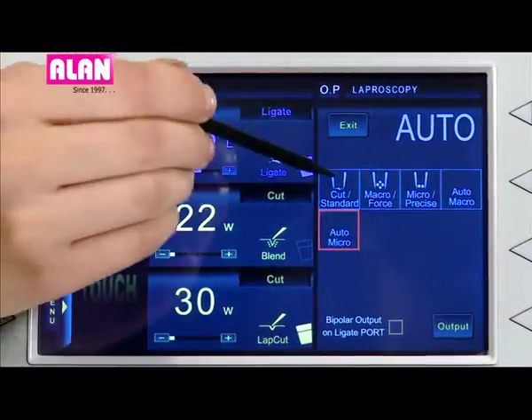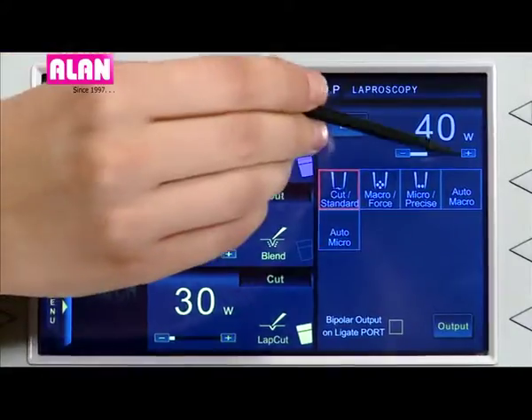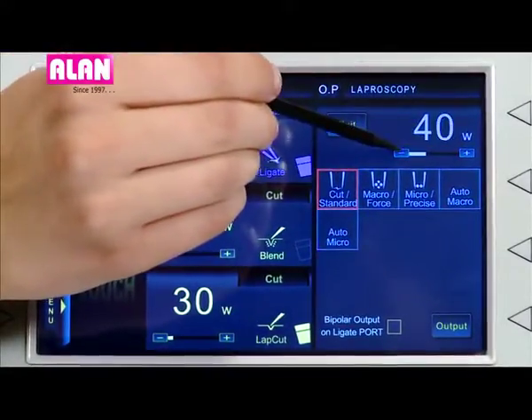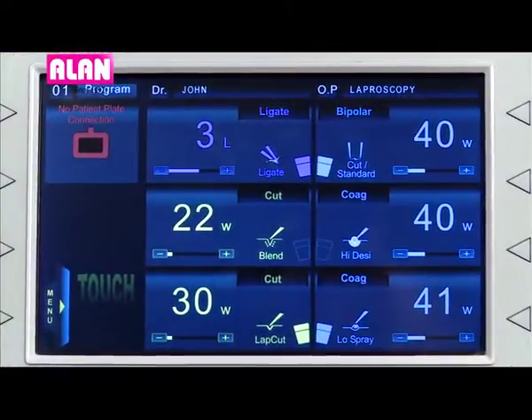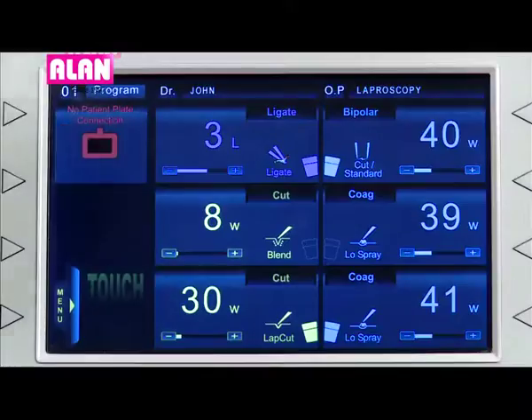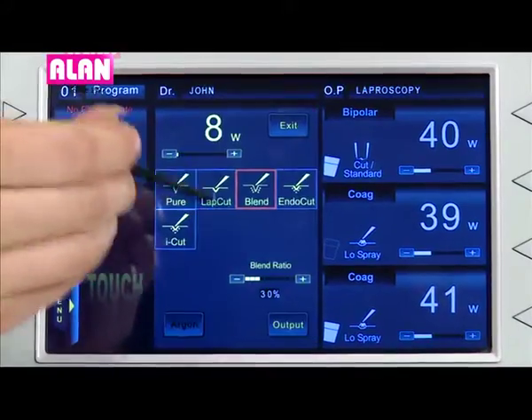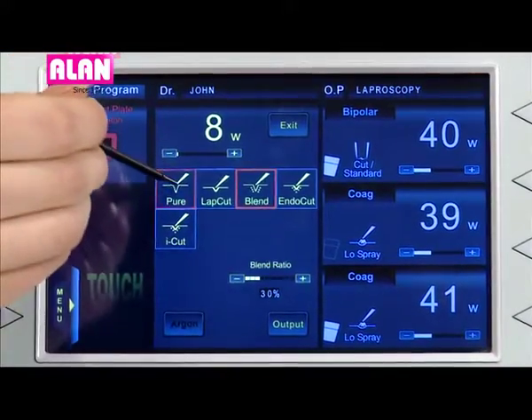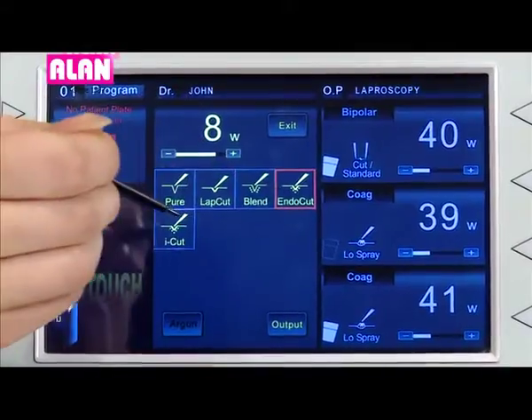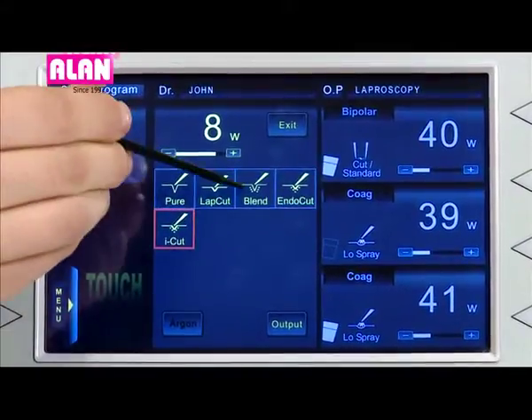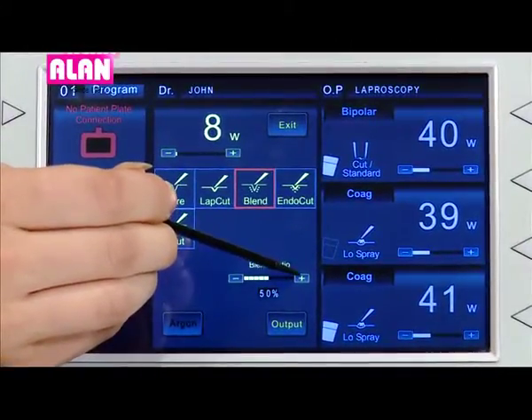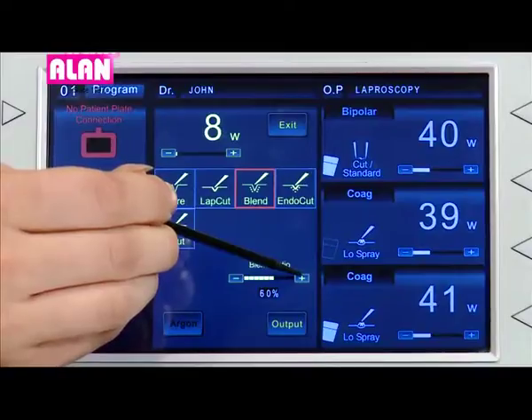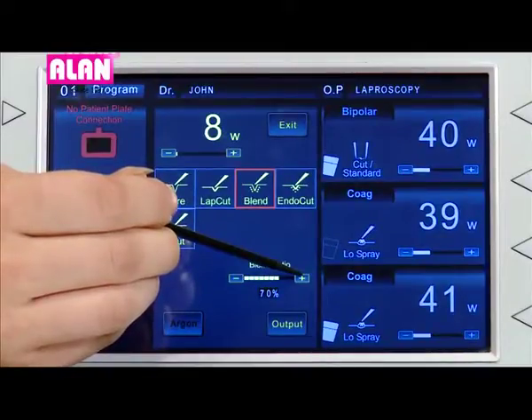The same interface is provided in all other windows. In Blend mode, we have cut ratio selection. The user has the option to select from 30% to 90%.